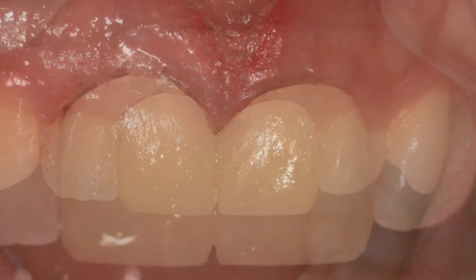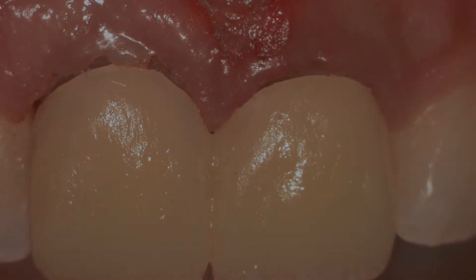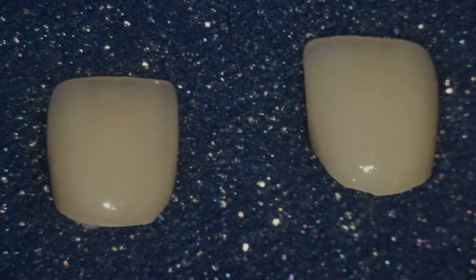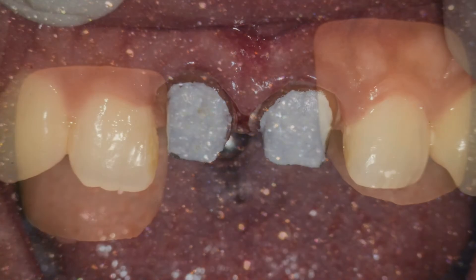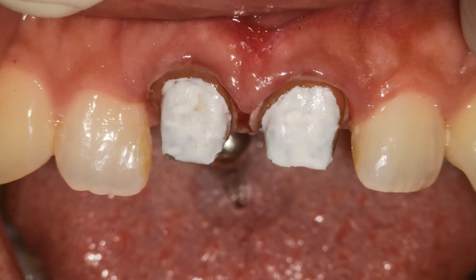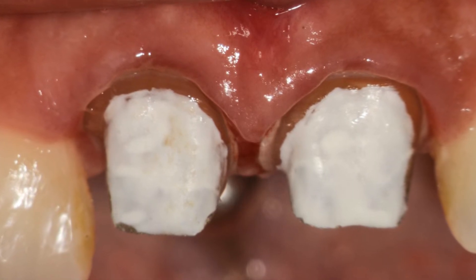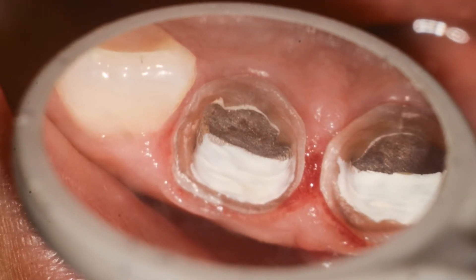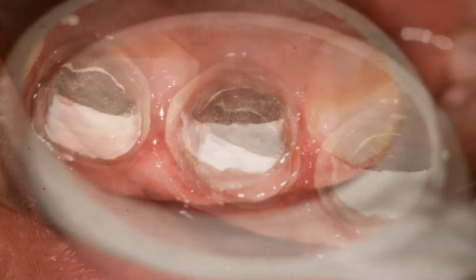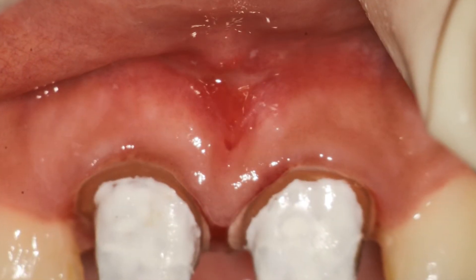We left the tissue for two weeks after the laser troughing, and you can see here the provisionals in place. The crowns are then removed, and here are the new crowns — two weeks after the original preparations, with troughing and the laser frenectomy. The occlusal/incisal view shows great healing in between, with beautiful visibility of the margins.